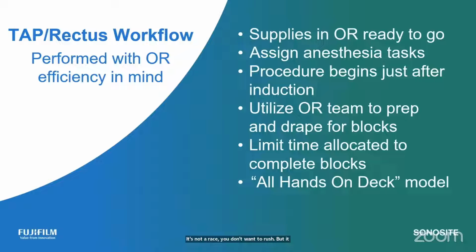These are pretty simple and straightforward. So if it takes longer than you deem acceptable, just abort it or give it to somebody else and see if they can get it done faster. But there should be a time limit to these blocks so that you don't delay the surgeons. If you do 3 of these cases in a day and you add 10 minutes per case, that's probably a little bit too long. 5 minutes would be much better.